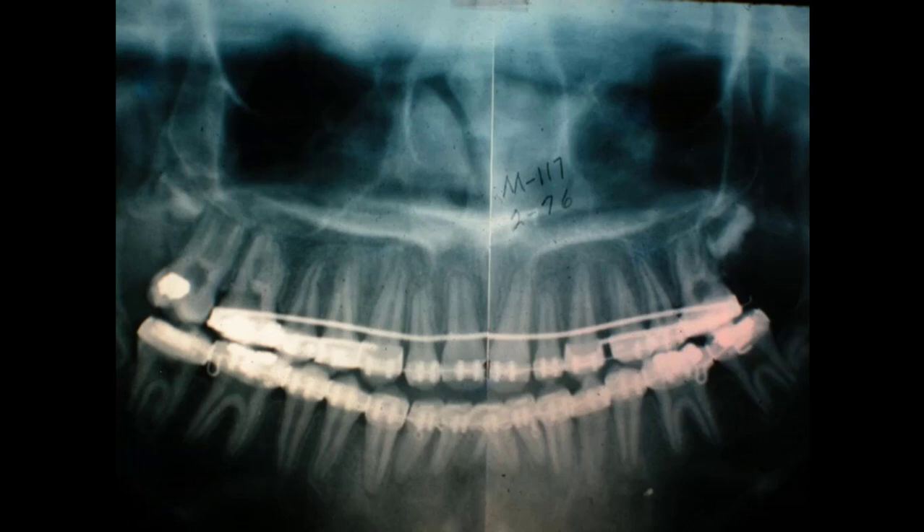The separator went as far as one would go, and then we cracked it out with another one. I was afraid that the thing would kind of collapse back, so I put a lingual bar in there to keep it spread out. I really didn't have to use that, but we did, and it worked all right and kept it out.